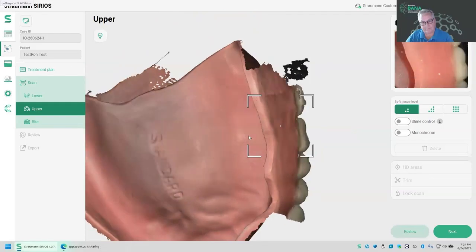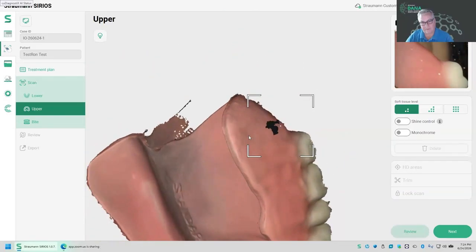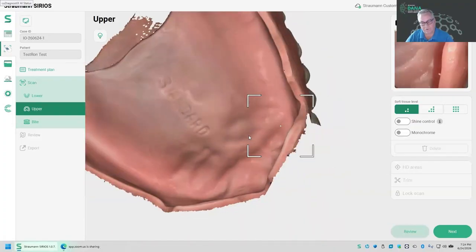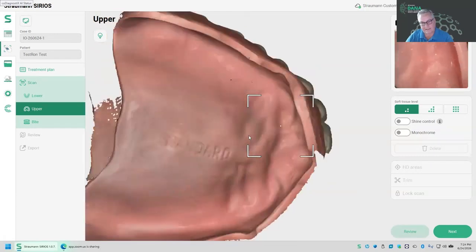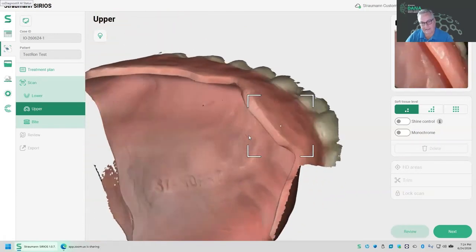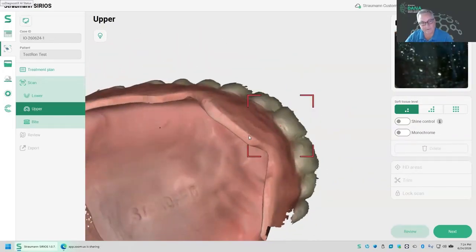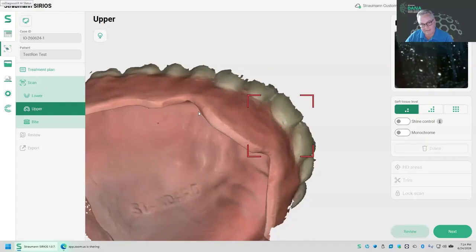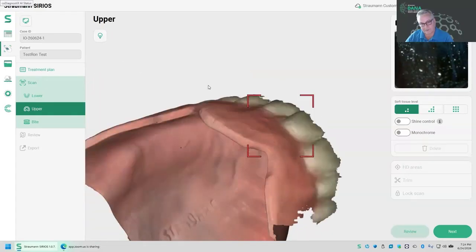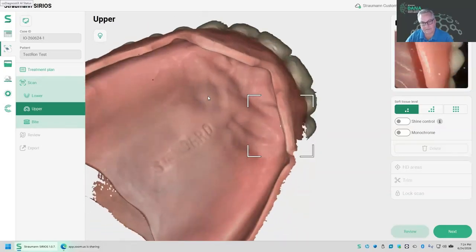At each point, I'm just, okay. And now I come a little further forward, building that facial aspect of the denture, keeping it connected to the flange. That's where I say this is very technique sensitive. I've seen many people, they'll come up here and then immediately try and go over the top and go all around. But I'm capturing each of these teeth and keeping it connected with this known surface, okay? And that's how we maintain our dimensional accuracy in scanning a denture like this, okay?